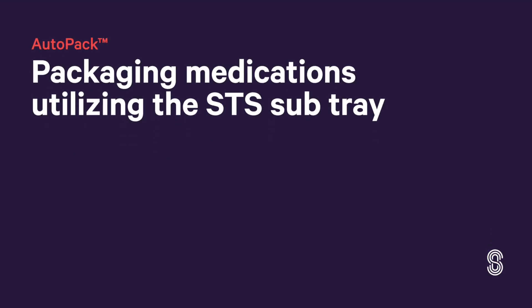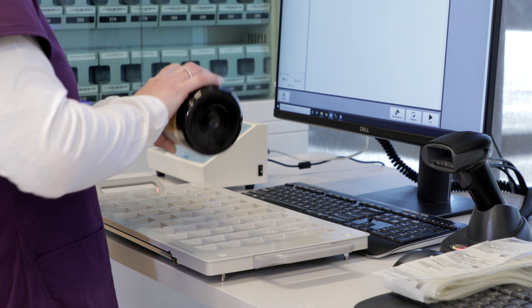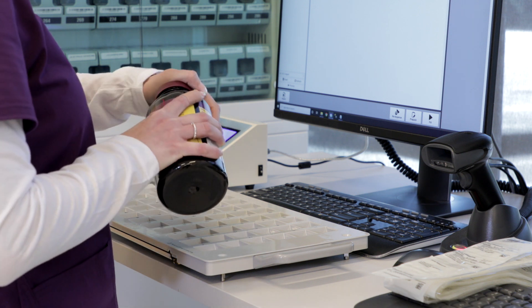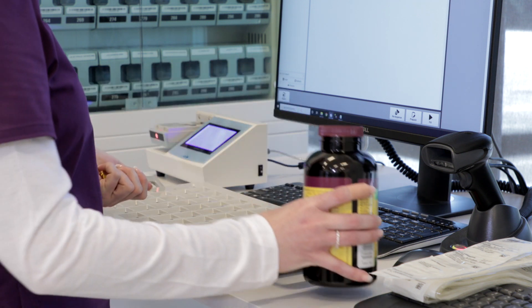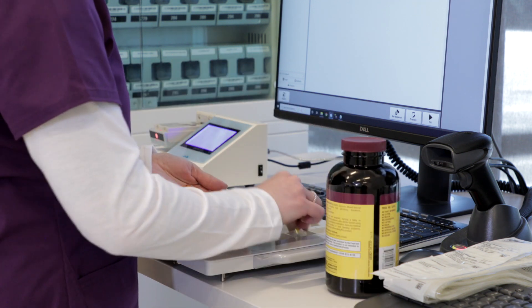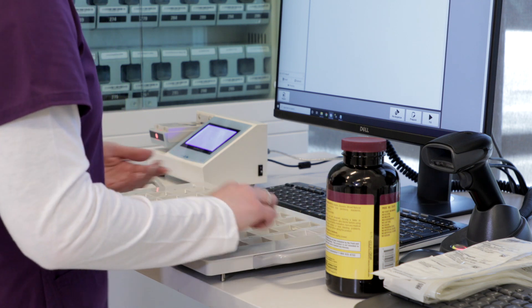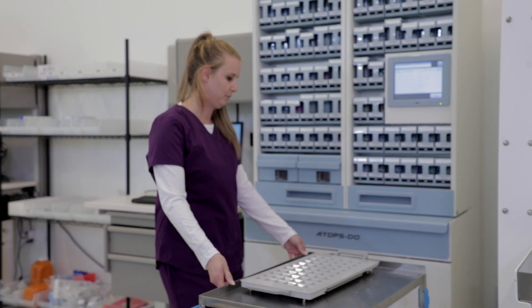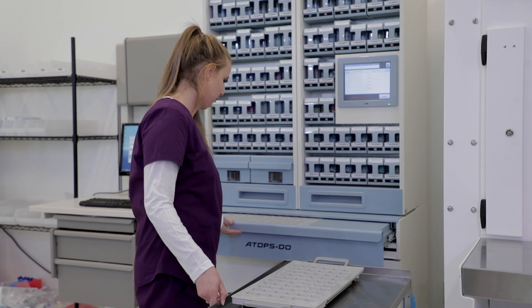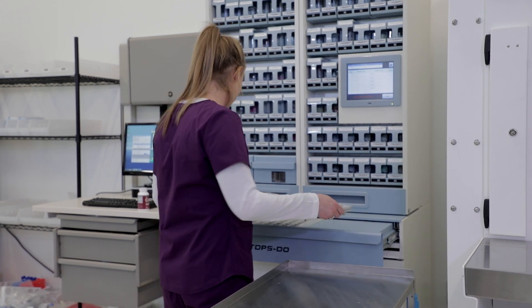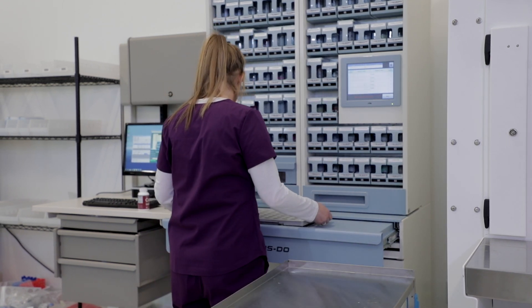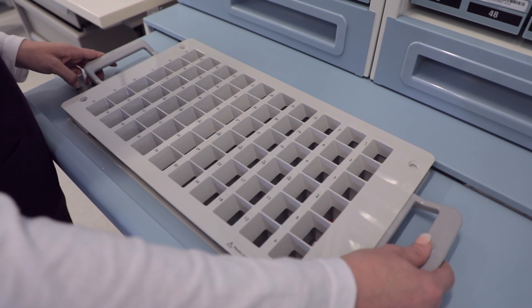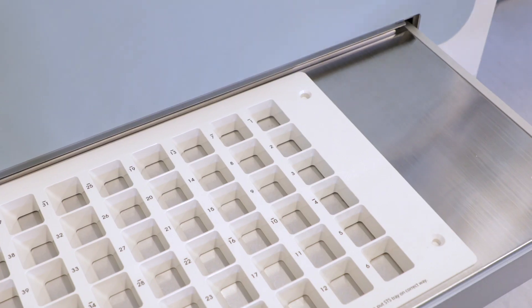An STS sub-tray allows for convenient pre-staging of medications that will be used in the AutoPak STS tray. Utilizing the STS sub-tray provides an efficient workflow where the AutoPak can continue to run canister packaging until the STS tray is needed. The user can then promptly transfer medications from an STS sub-tray to the STS tray.